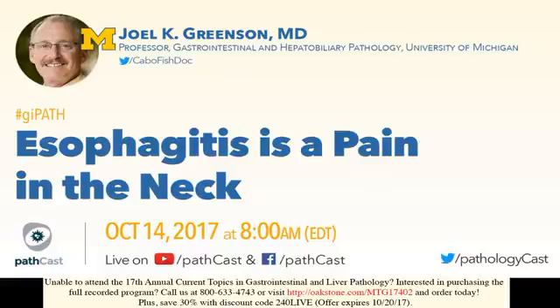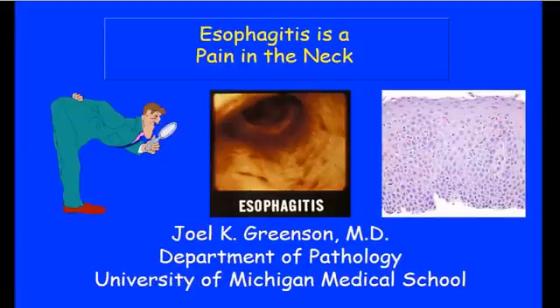All right, we're going to start off talking about esophagitis. And I don't know about your practice, but I get a ton of esophageal biopsies. Mostly now it's either for eosinophilic esophagitis or Barrett's. I'm not giving the Barrett's lecture. Somebody else is going to, I'm sure Dr. Montgomery perhaps is going to talk about Barrett's and dysplasia and that whole nightmare. But I'm going to talk about the easy stuff, which is just esophagitis, inflammation in the esophagus, and how much you can do with these small mucosal biopsies.